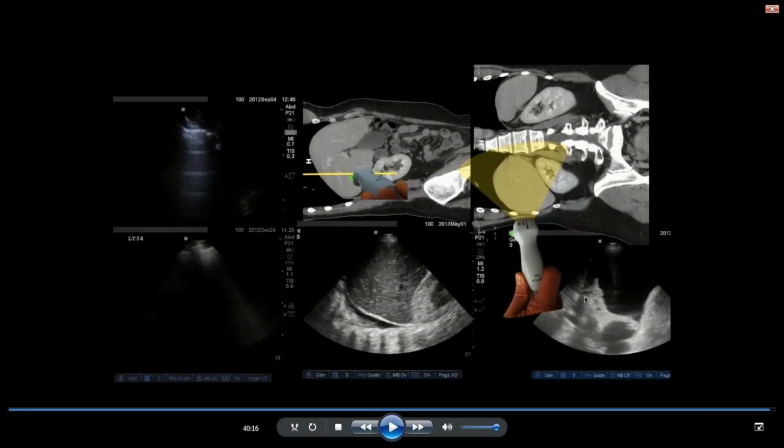So they actually did not discuss the A pattern, A lines very well. Their sensitivity and specificity were quite reasonable given that they were comparing to CT angiography. And I believe they recorded a sensitivity in the 74–75% range and a specificity of 95%. And one of the greatest things about lung ultrasound is it can help you move away from some of the things on your differential. And I think at this point I'll let Dr. Bhagra extrapolate on that and tie this all together.